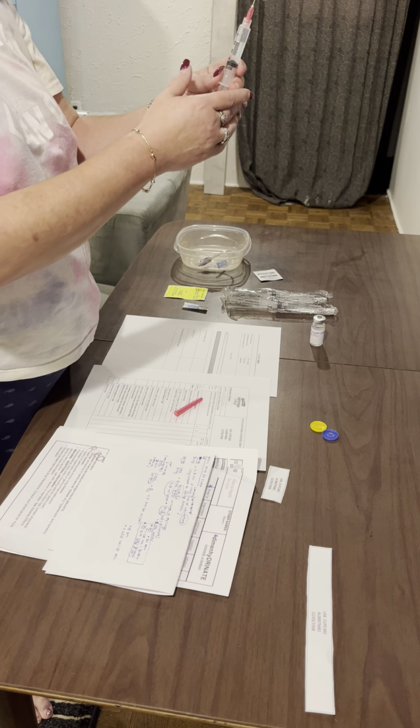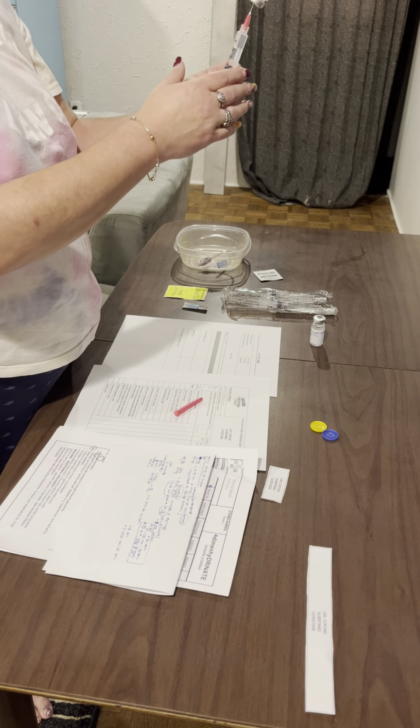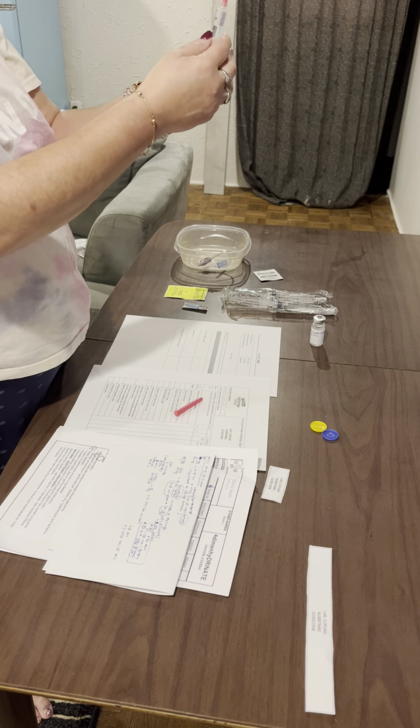We would discard this, get an entirely new syringe, and go through the whole process again. Because if you were to use this now, it would be incorrect because there's a big air bubble there. And if you push this back into the normal saline, it's going to push medication into the normal saline, and it's going to make this incorrect.